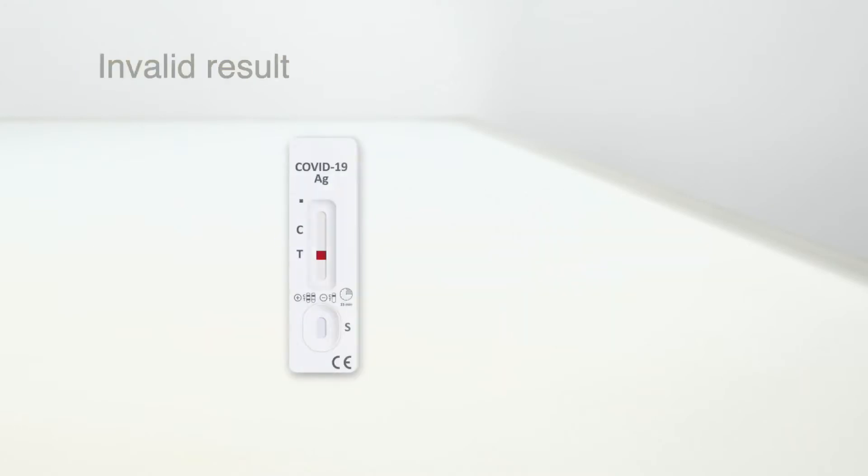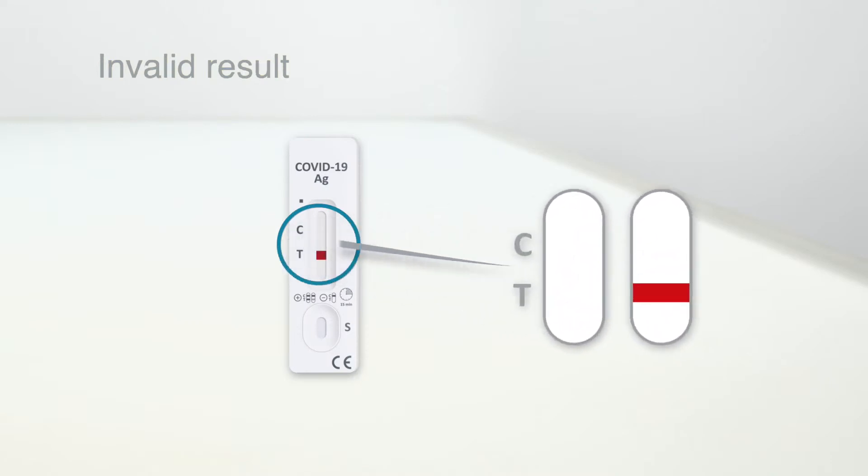The control line indicates that the test has been performed correctly and should always be present. If no control line appears, the result is invalid. Repeat the test with a new test cassette.